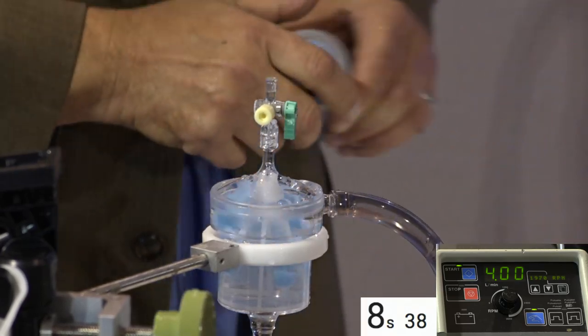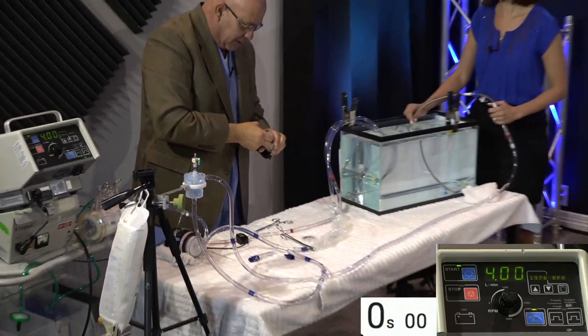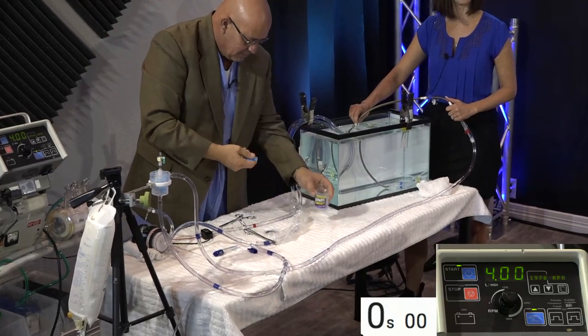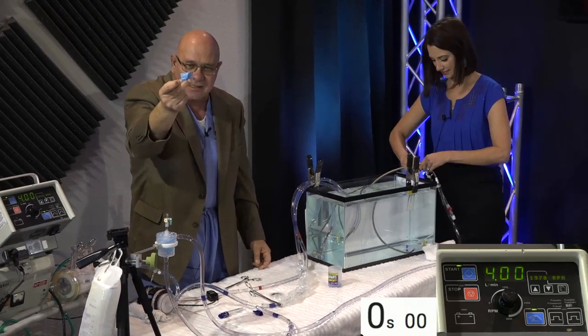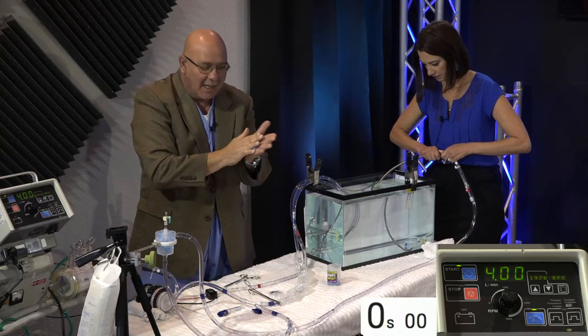So we're going to do one more. Only this time, I'm going to be more generous. Oh, my. I told him to start with less amount just in case it didn't work. This time, I want you all to see this. That's a lot of clot. It is. Yes, okay. I will roll it like it's an iliac.